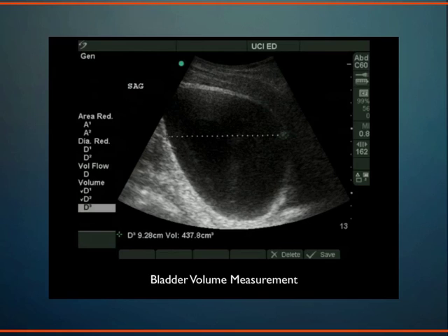Yes? When would you want to measure the bladder volume? Yeah, like why do you care about measuring the bladder volume? It's something that we want to know about actually quite frequently in the hospital, at all ages. In little babies who have a fever, we want to basically catheterize their bladder, put a catheter into their bladder to get the urine out, to send it off for urine culture. Well, some of them just urinated in their diaper, and you would unnecessarily put them through the procedure of a bladder catheterization, which is painful. So you could avoid that; you have to wait until the bladder fills up, basically. So I train my nurses to do this, and they take a peek at the bladder before they bother putting a catheter into a small child.